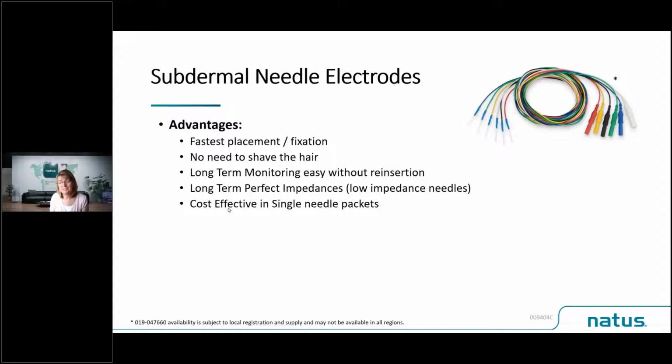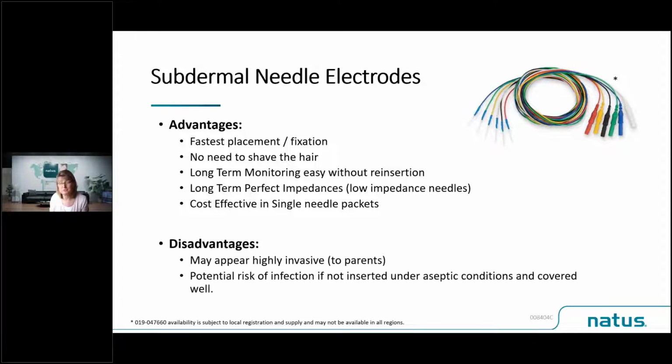And they can be very cost effective, particularly if you're purchasing the needles in the single needle packets. If one falls out, you only need to open one single needle packet, and that makes them super cost effective for you. Disadvantages, they do appear, or they can appear to parents to be highly invasive.